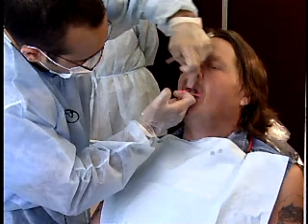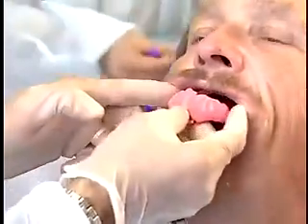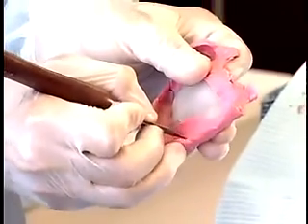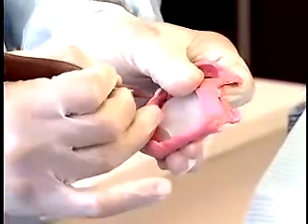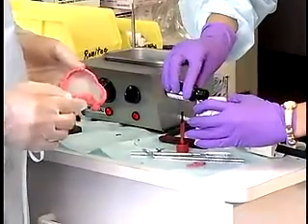Allow the material to sit according to the manufacturer recommendations. Remove the maxillary final impression tray. Inspect the impression to determine if it's acceptable. Remove all excess material from the tissue surface of the tray using a sharp knife. Paint the tray with polyether adhesive.